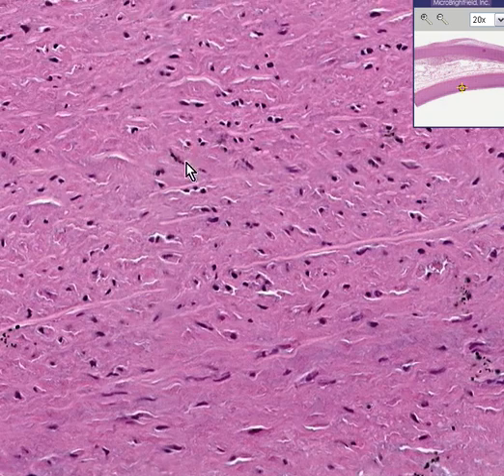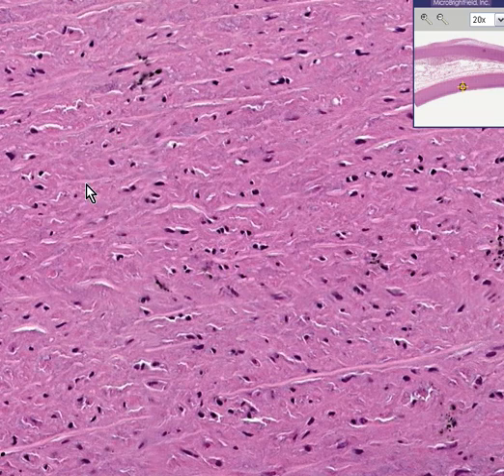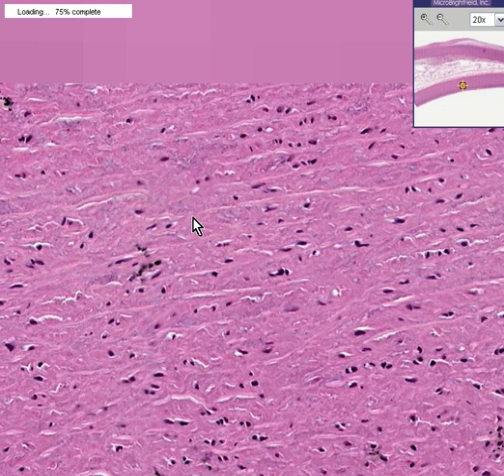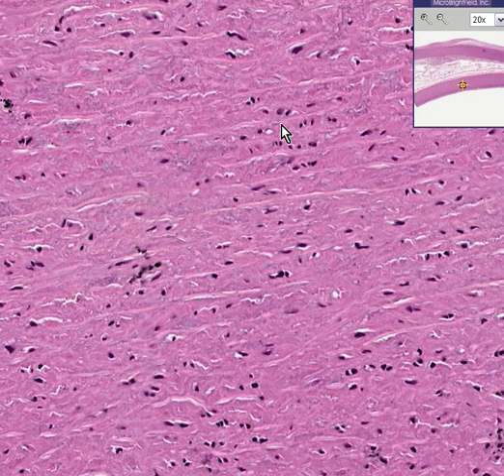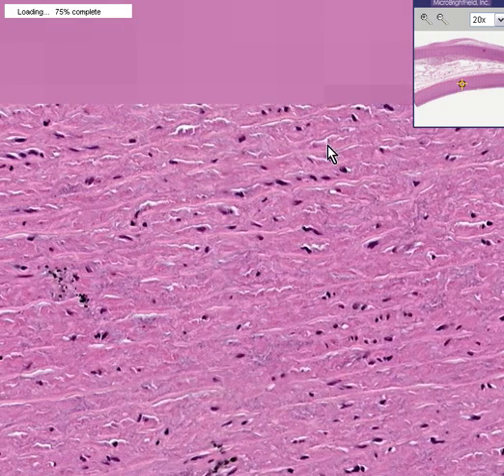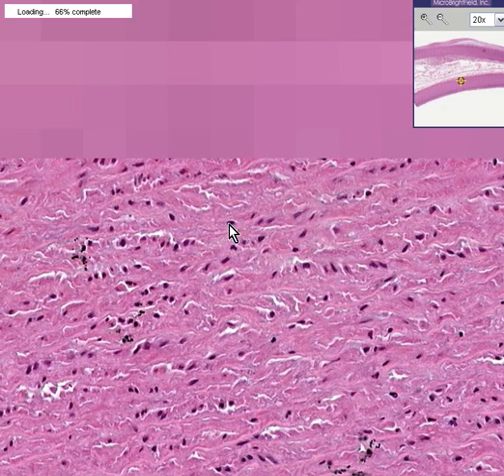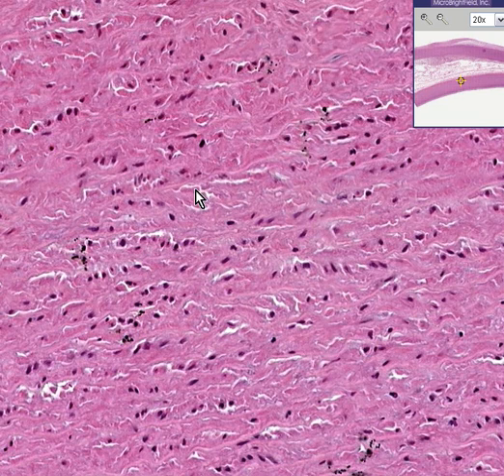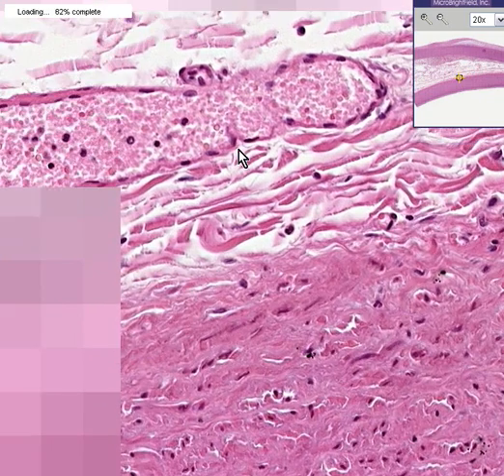Please note that these little whitish, slightly refractile wavy lines represent the elastic fibers, even though this is not an elastic stain. If this were an elastic stain, these whitish slightly wavy areas would be intensely black. This is a fairly normal cross section through the wall of an aorta, which is 90 percent elastic fibers, fibroblasts, and smooth muscle cells. Out to the adventitia you see many blood vessels — the so-called vasa vasorum.